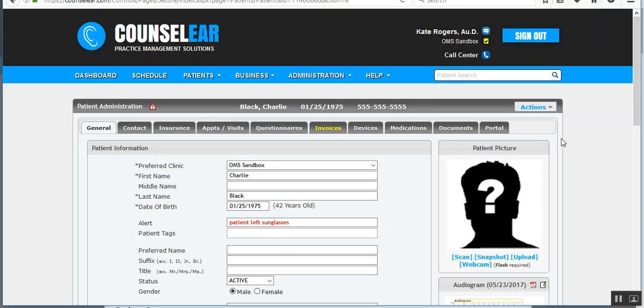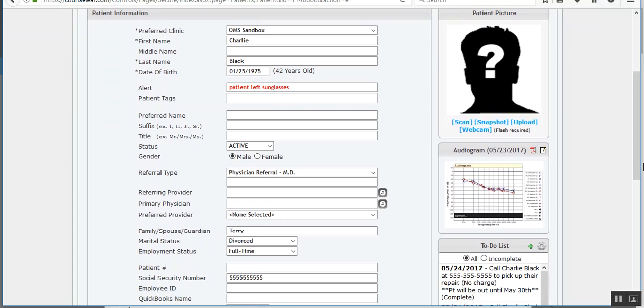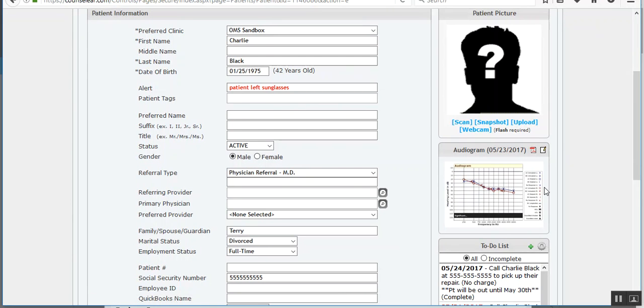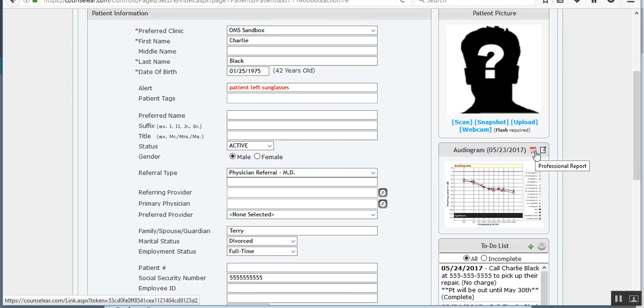In the patient's administration screen, we have a quick image here under their profile picture of the last audiogram. You then have options to edit and view the entire professional report.